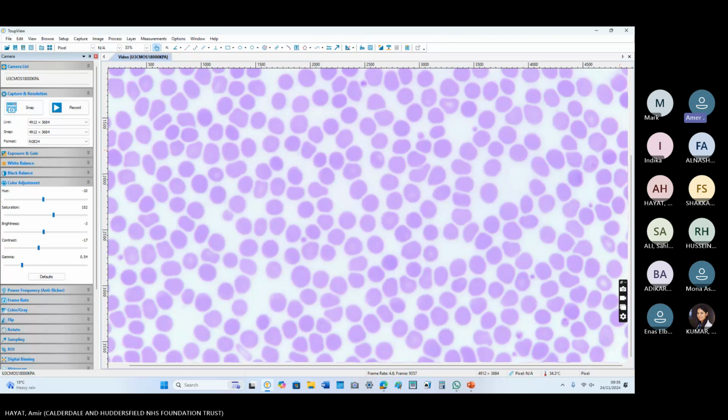If the EPO level is low and cell count is high, it means there is some malignant element involved. If the EPO level is high and this is the blood picture, then I would think this is secondary polycythemia, because that cause leads to elevation of erythropoietin, and now as a response, the red cell count is high.